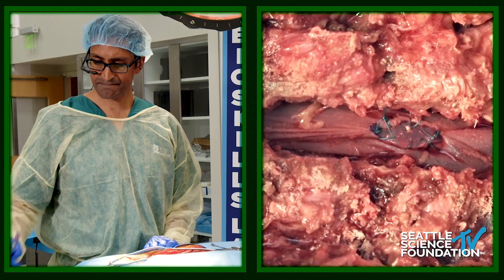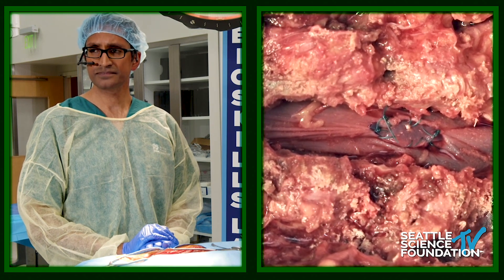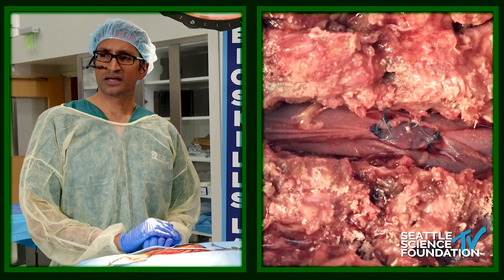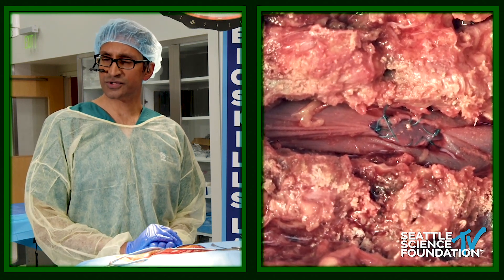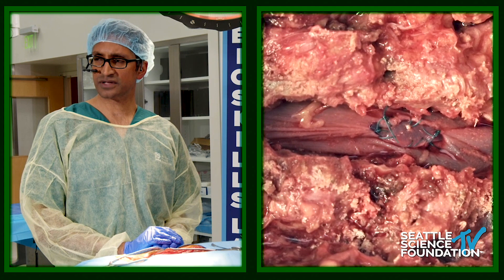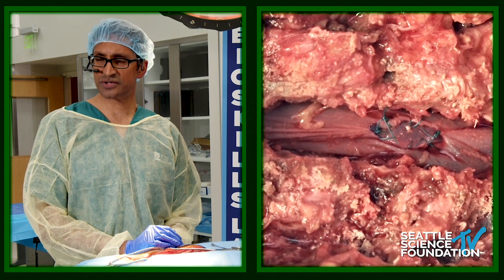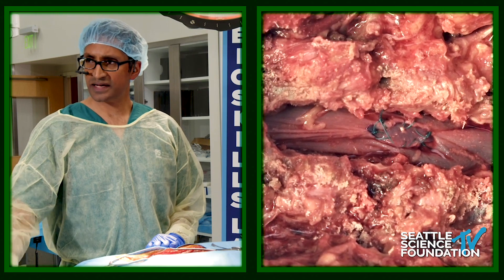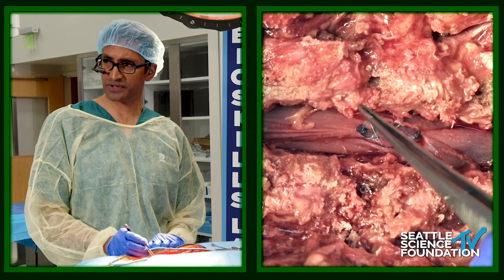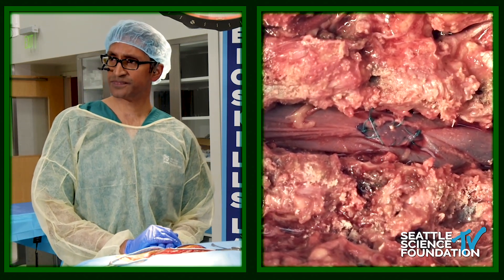Simple technical question: locking versus non-locking sutures — I was always taught to do locking sutures. Is that just not necessary? You can go either way. With these very close sutures, I've found that locking sutures can pull the graft in a certain way where there's a little bit of a dog-ear or something that keeps a little hole intact. So I tend to just do a baseball running stitch — a simple running stitch. I probably would have put about twice as many sutures along both limbs, but this highlights the technique within the time constraints.